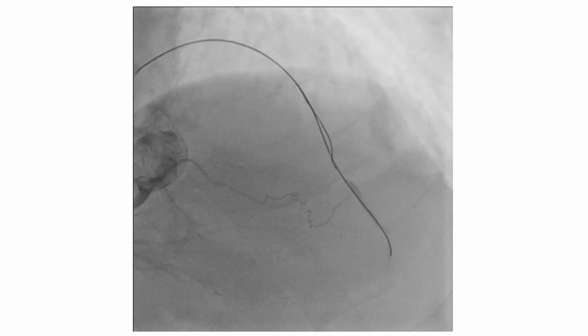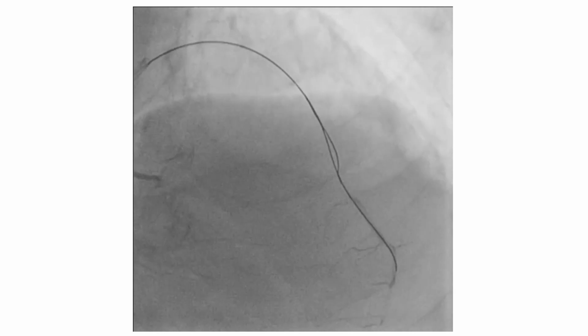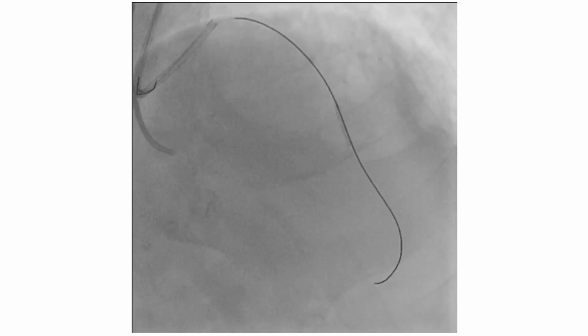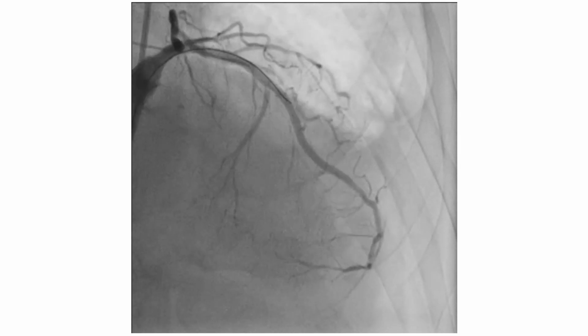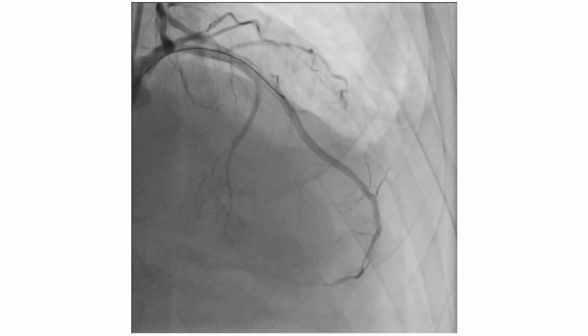Going back to the first case, once you are sure that you are intraluminal, you can push the wire further, dilate the lesion, and stent, and this is the final result. And now you can treat the other vessel.